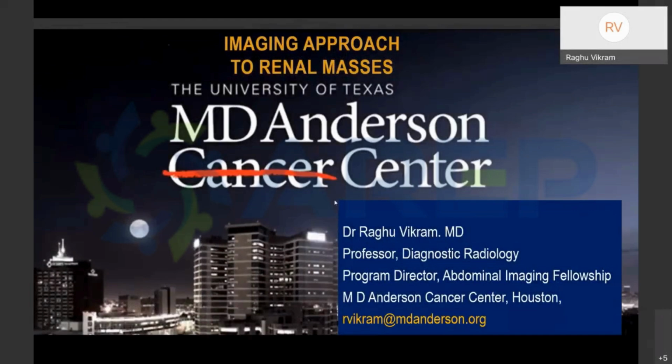I'm going to start talking about imaging approach to renal masses today. I'm going to give a very brief overview of the entire renal carcinoma. I won't spend much time on benign renal masses, although we'll talk about it while characterizing it. We'll concentrate on cancer because that is my day job, looking at a lot of renal carcinomas.